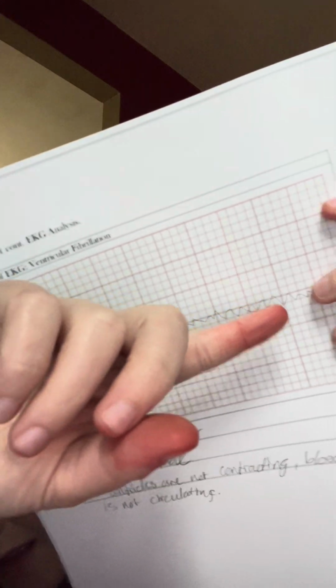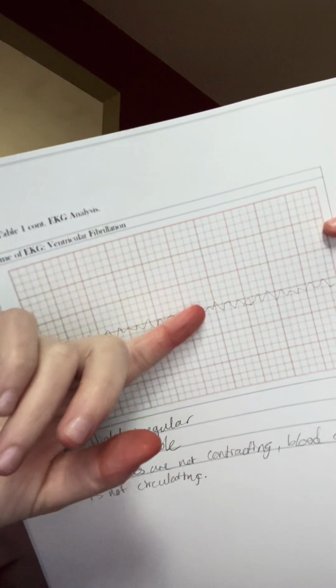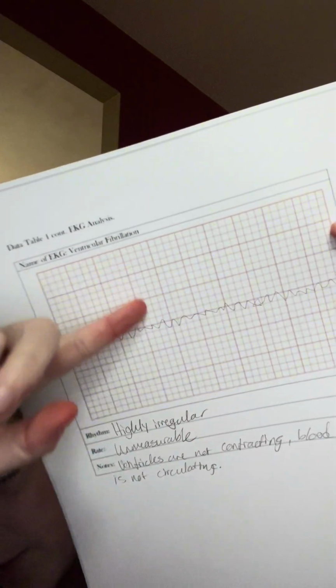So its rhythm is highly irregular, its rate is unmeasurable, and it's when the ventricles are not contracting and blood is not circulating. So it kind of just goes at a little baby rate. It just goes. There's no up. It just goes. Compared to this one, it goes up and then it goes and it goes up. So yeah, those are my 4 comparisons to the normal EKG.